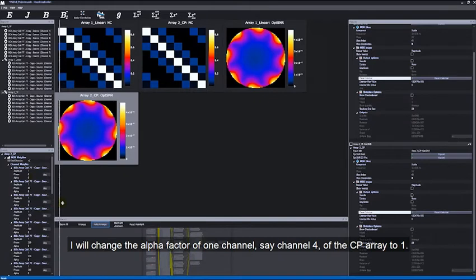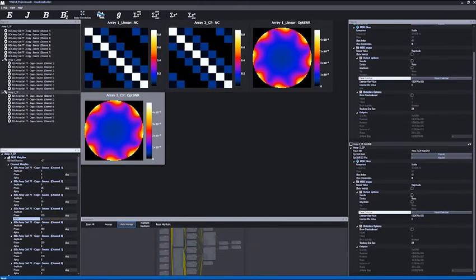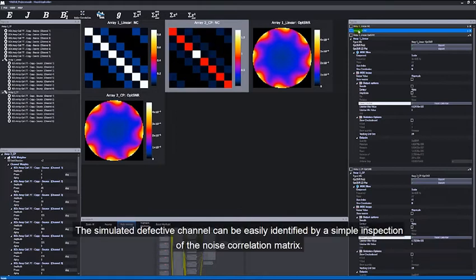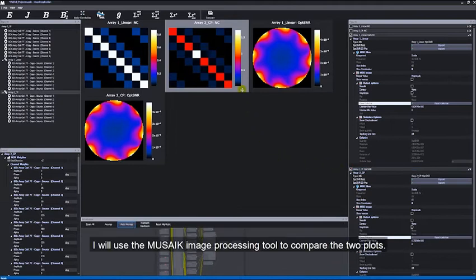I will now change the alpha factor of one channel, say channel 4, of the CP array to 1. I will also reset the scale of the color bars for all open figures. As you can see, the noise correlation matrix already reflects this change. The simulated defective channel can be easily identified by a simple inspection of the noise correlation matrix. There might be a difference in the signal-to-noise ratio fields too, but this might be difficult to spot in this view. I will use the Musaik image processing tool to compare the two plots.